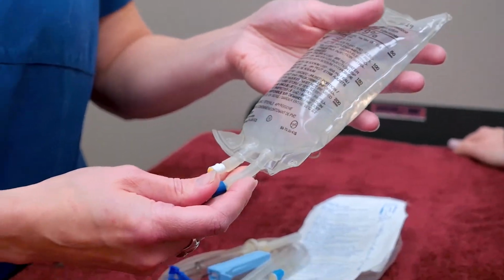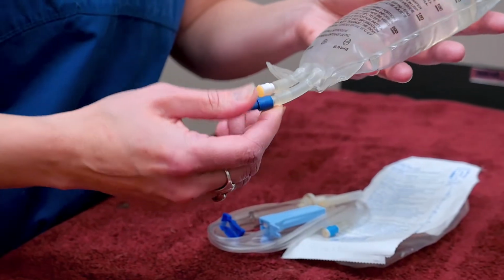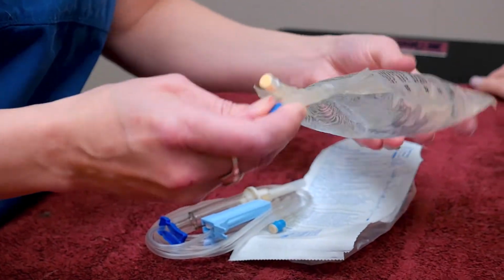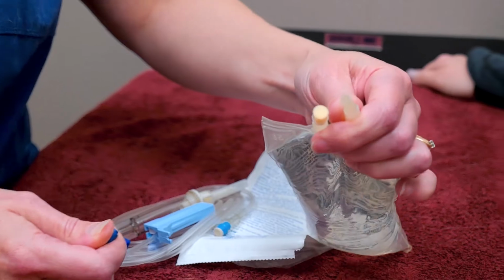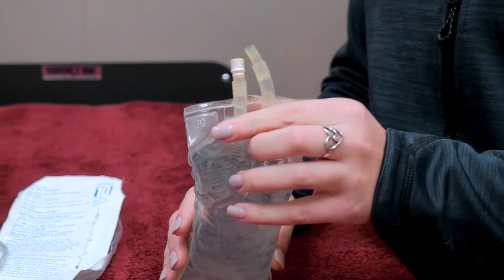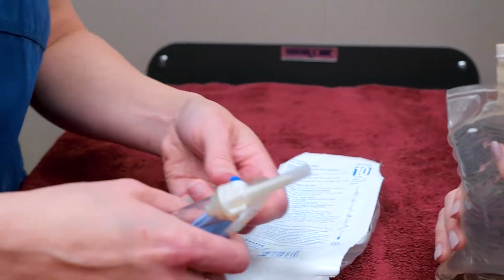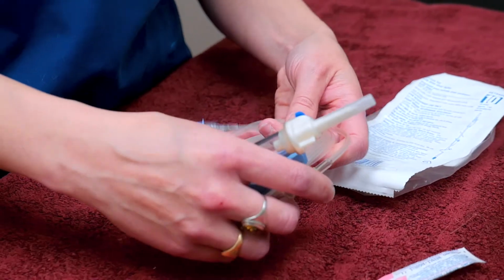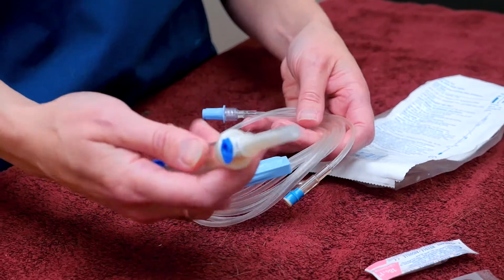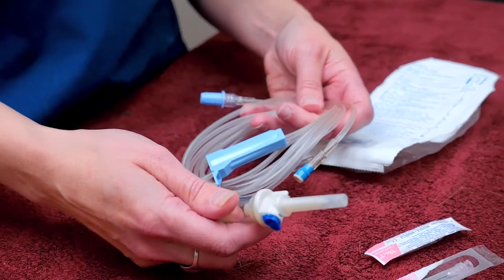When you first get the bag out of the packaging, the first thing you need to do is to remove the end off the one side here so that there's a hole that you can put the port into. So Chelsea's going to hold that for me just now to keep that end clean. When we're setting up this procedure, we will send you home with one of these intravenous lines as well, and there's also some prep that needs to happen with these.